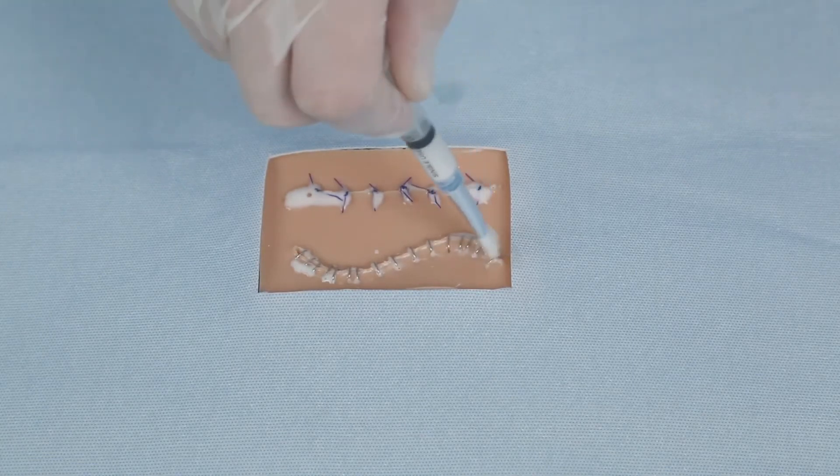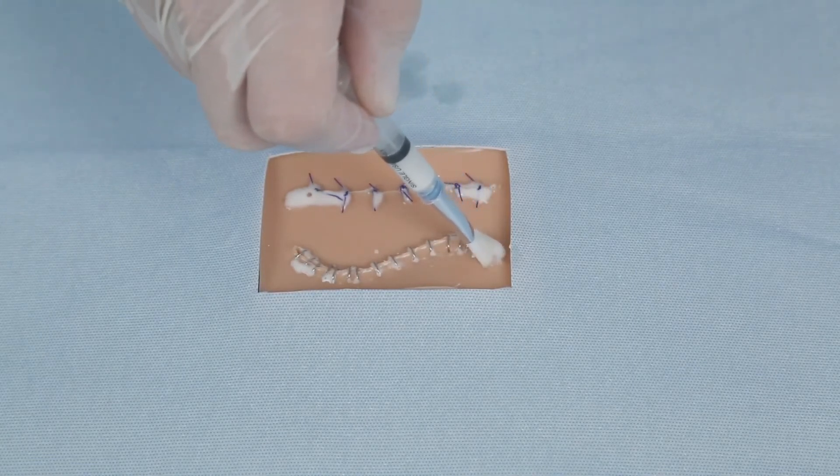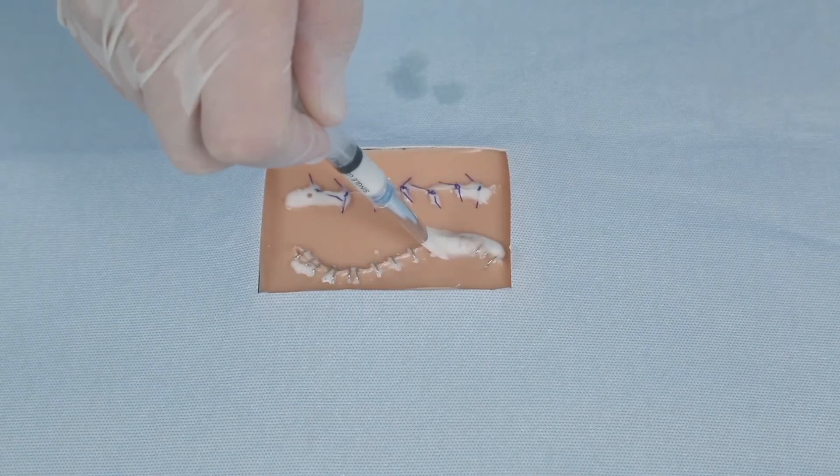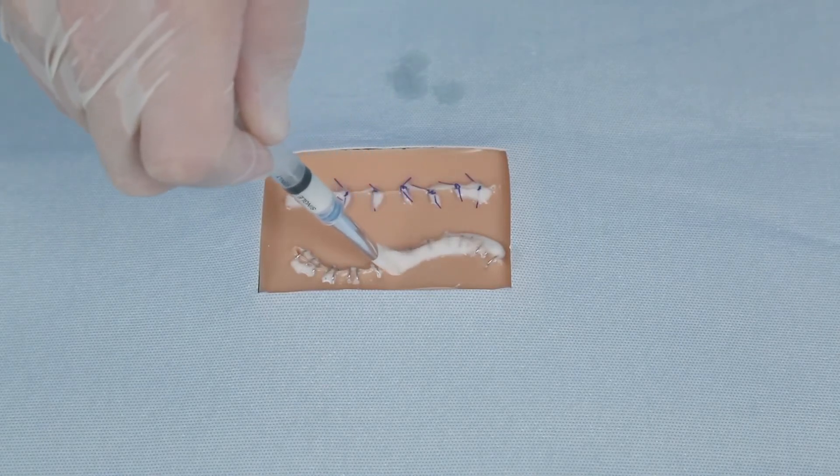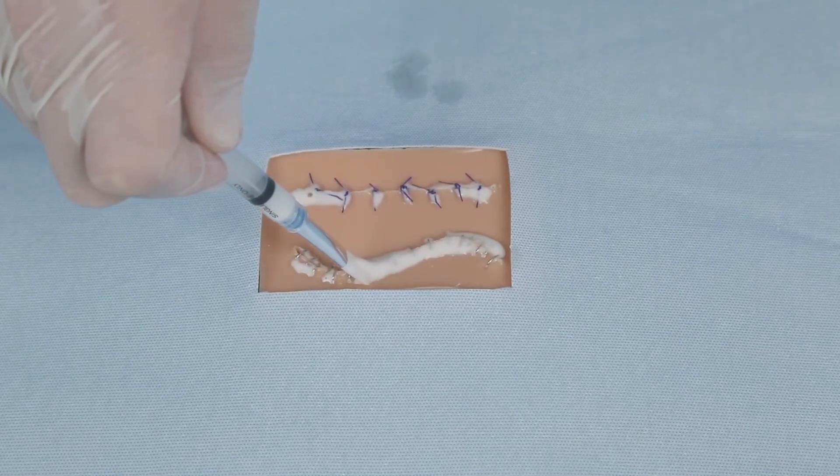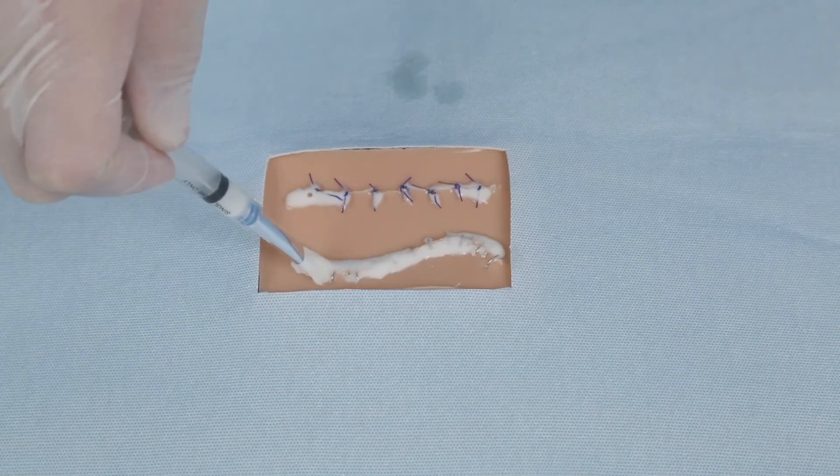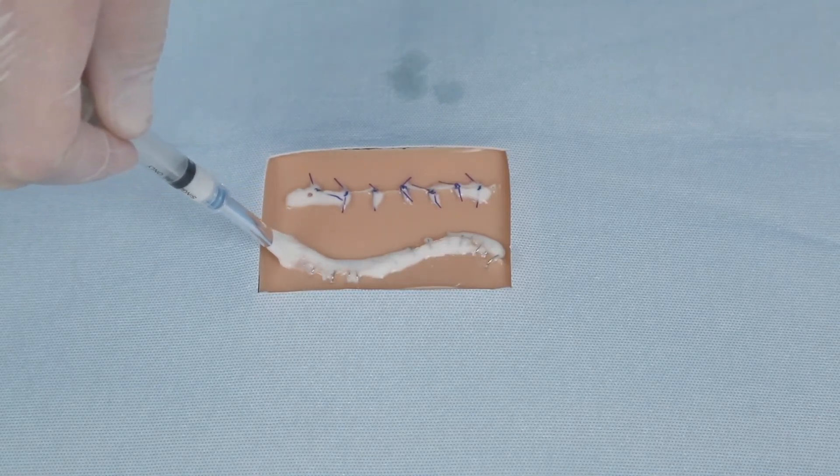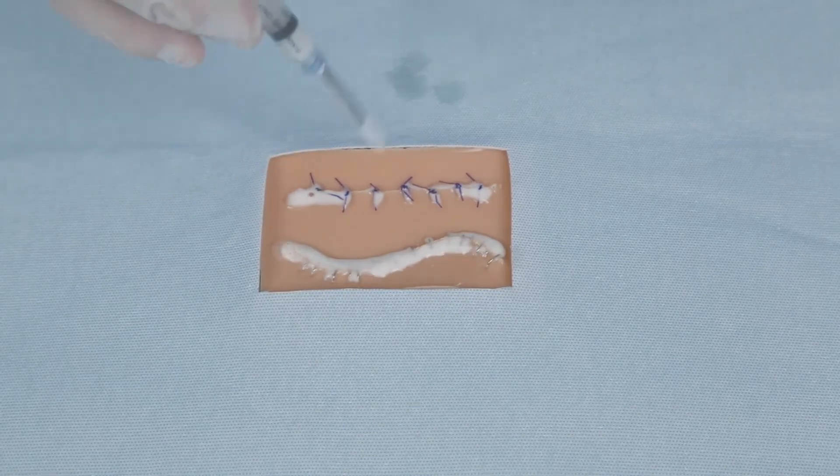Within two minutes the SutureSeal polymer will become an adherent gel. SutureSeal will remain on the suture or wound area for approximately 14 days and will biodegrade away slowly. Apply a second application of SutureSeal if the suture or wound is not completely healed after 14 days.